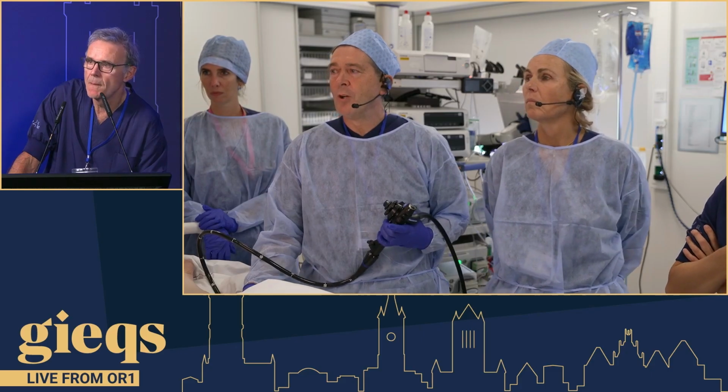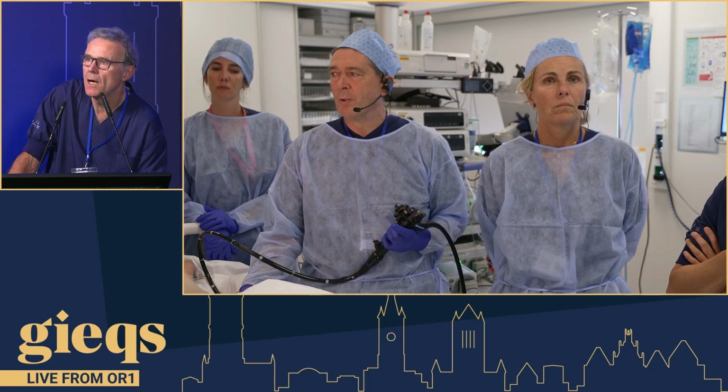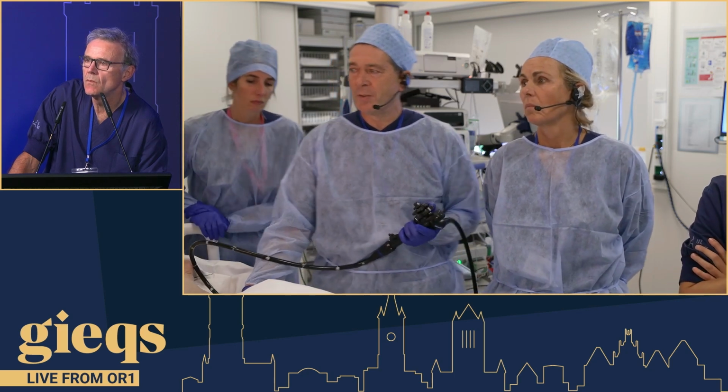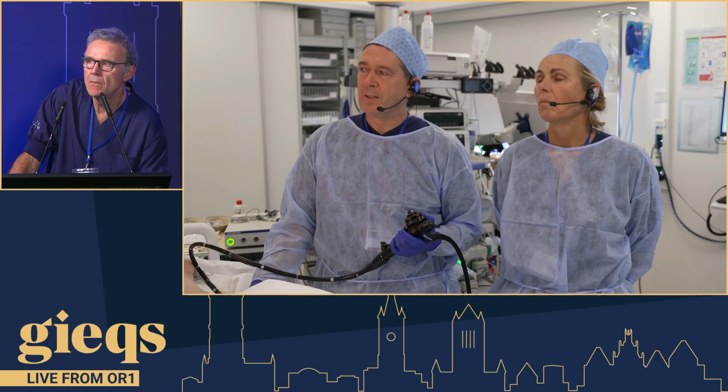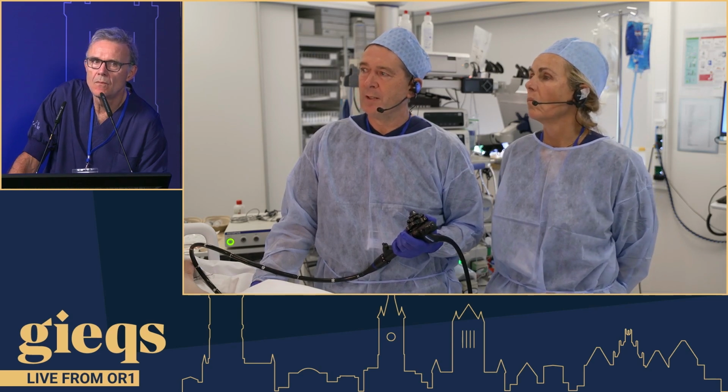So there was a very long redundant colon. Because of that, I've elected to go with the CF scope, which I have to say is my preferred option, unless there is severe diverticular disease or something like that.